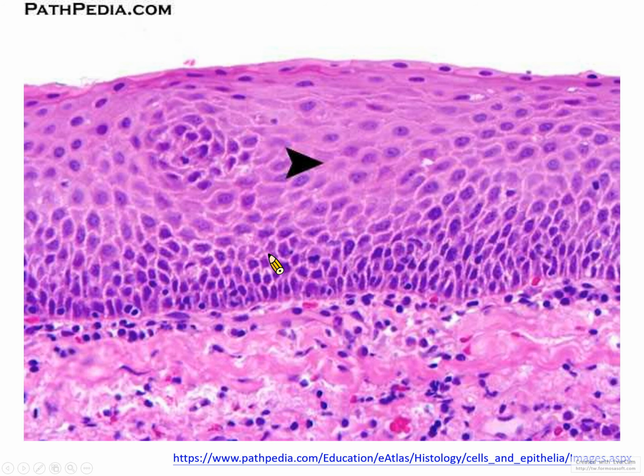Compared to a normal squamous tissue, the squamous cells grow from the basement membrane and gradually become differentiated toward the surface. So you can see that in the normal tissue, the squamous cells have quite a regular alignment and a very clear boundary.